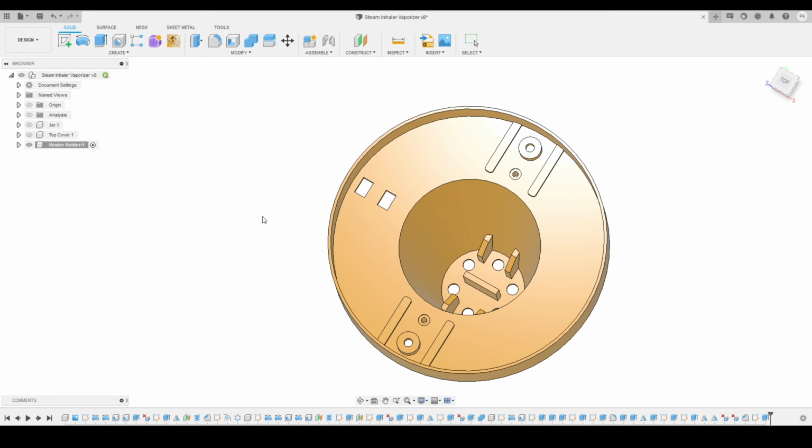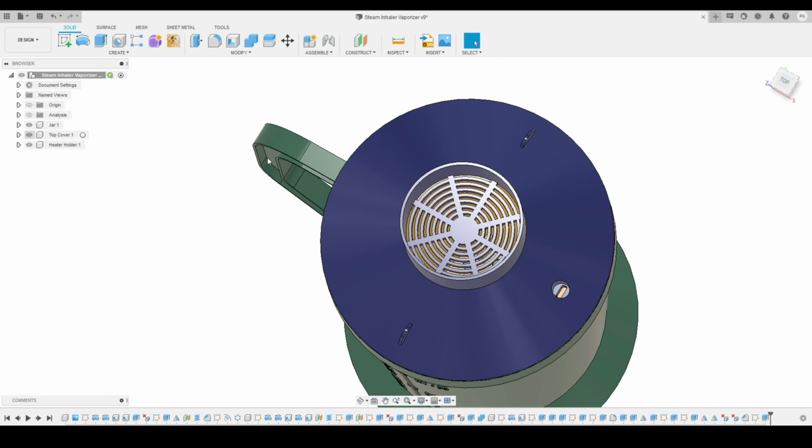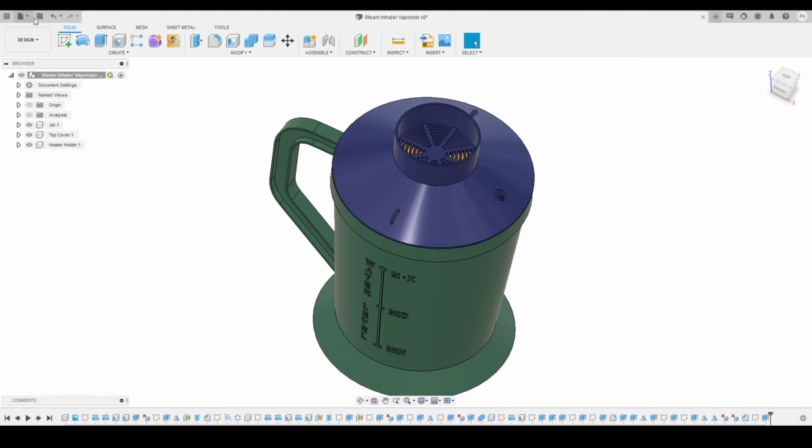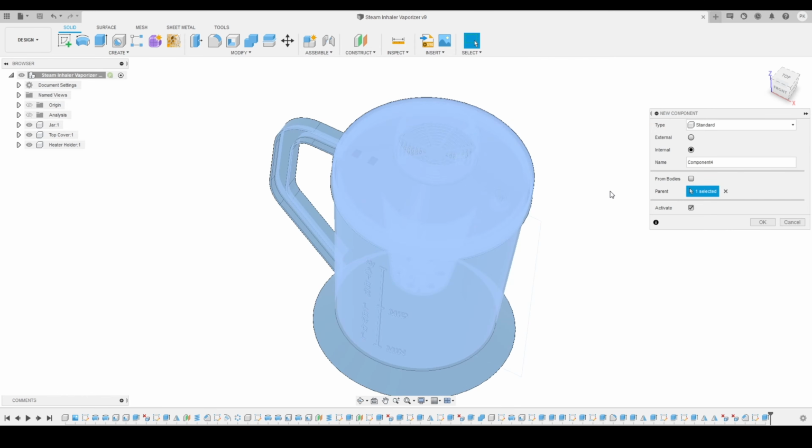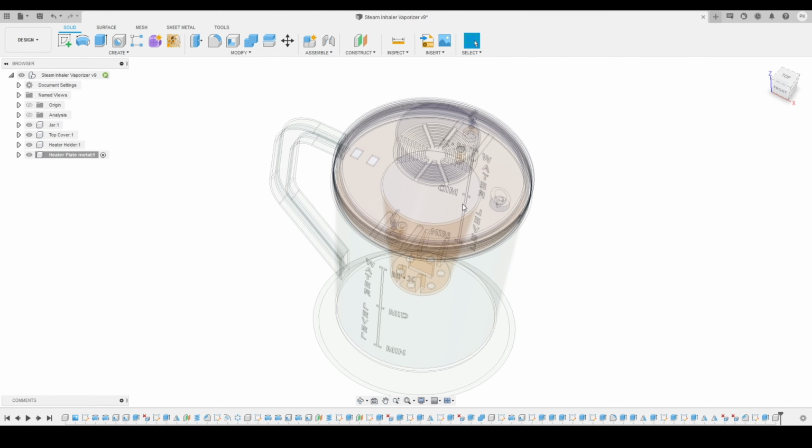And now what I can do is click on save since we had just finished the heater holder component. Now we'll activate the top level steam inhaler vaporizer over here, and here you can see we had finished all these 3 components, and we'll click on save. Now we'll go to the create panel again. Here you can see I will click on new component, and now we are going to create a heater plate. So I will just give it the name heater plate, and we'll press OK to activate and start the component.